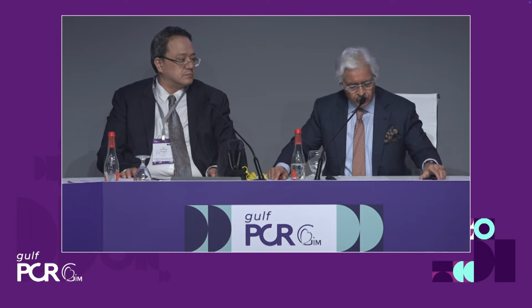Because finally, at the end of the day, there are certainly limitations of finances, even in the most developed countries, and therefore we need to address those issues and have more valves available to us.